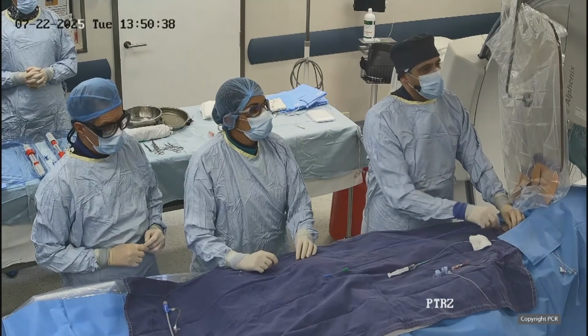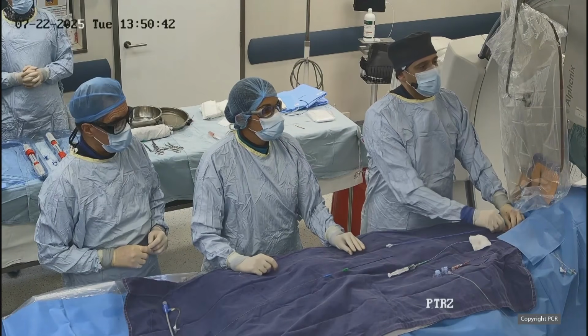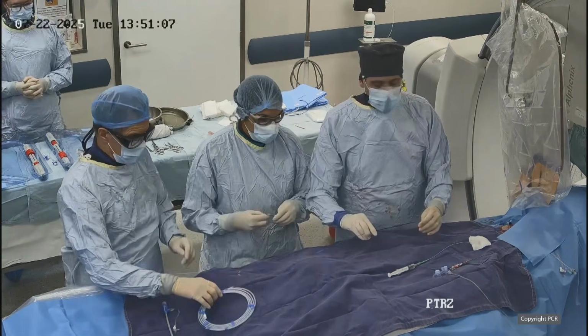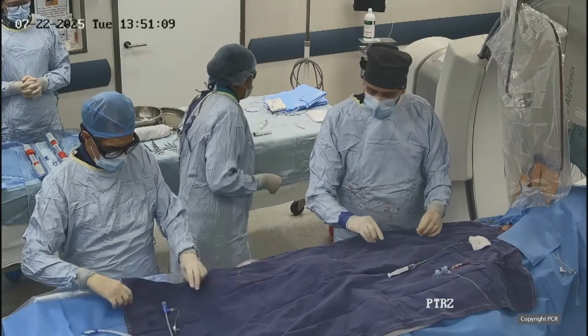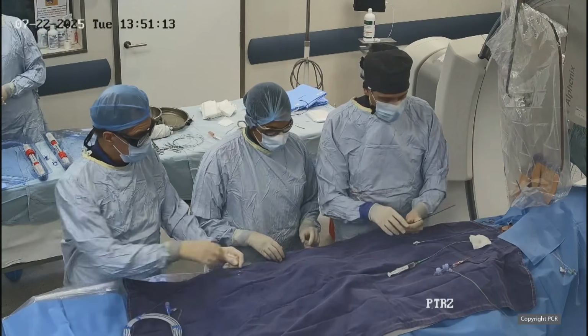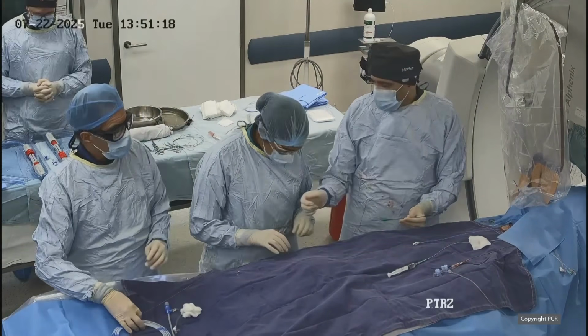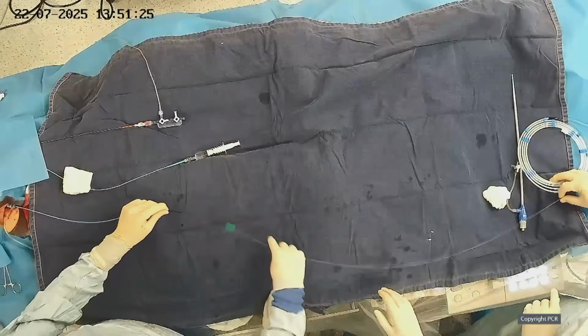It's called Shade wire, and it's really stiff. So you can try to take a look. It's a very stiff one. We have our catheter in place. Okay, so we keep the wire there.